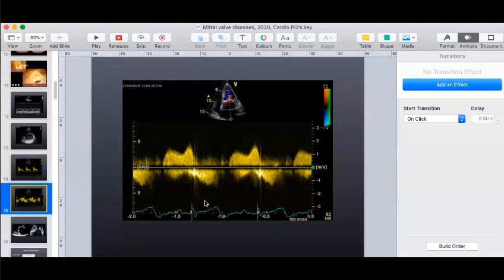Diastolic. A wave is greater than E wave, sir. And then atrial reversal wave is also larger, sir. Well, atrial reversal wave, you don't mention it here. Atrial reversal is a wave which you see in the pulmonary vein. So the atrial reversal and pulmonary vein sampling is what would be the one. So here you don't comment about atrial reversal.